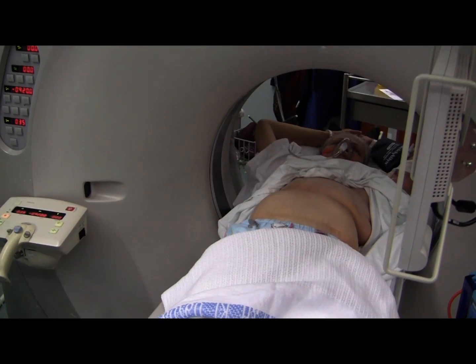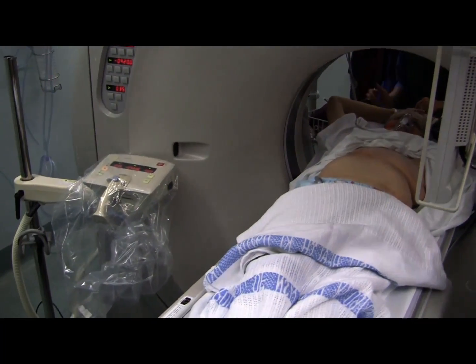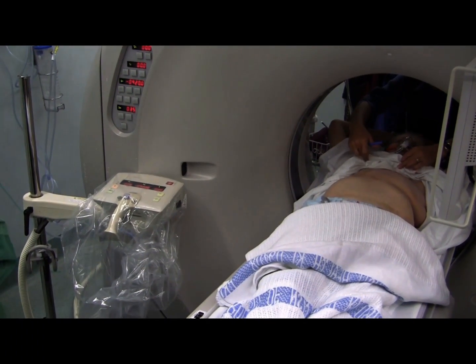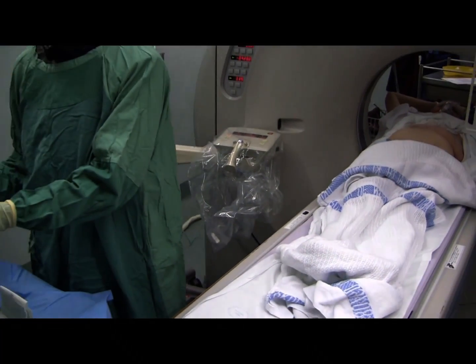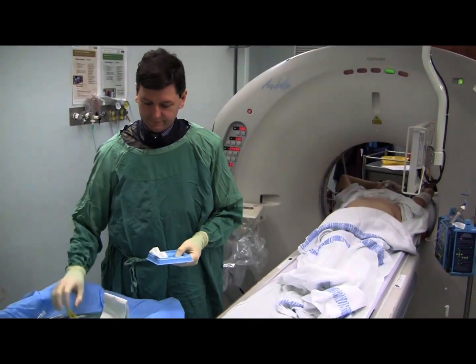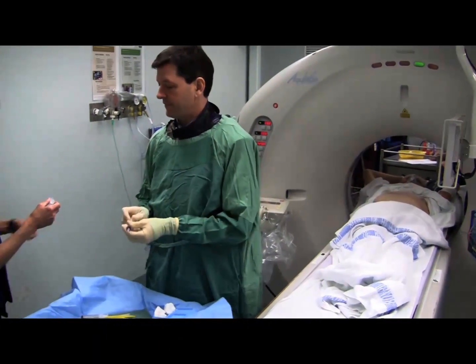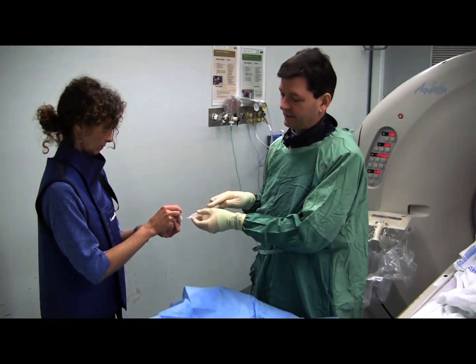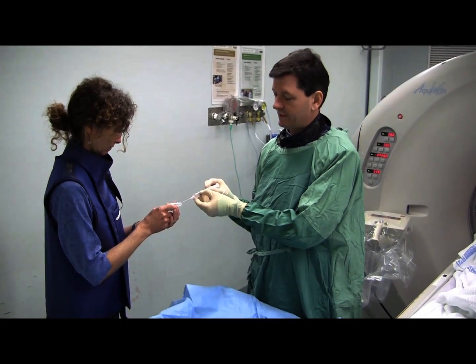Okay. So we just have the usual setup here for Fluoro CT, sterile cover over the controls. I use the wrap from the prep pack just to function as a sterile handle. Pick up a bit of betadine, and away we go. Local anaesthetic. Going to be using lignocaine 1% today in the usual fashion. So a combination of fentanyl, midazolam, and lignocaine 1% should get us across the line for a relatively straightforward procedure like this.